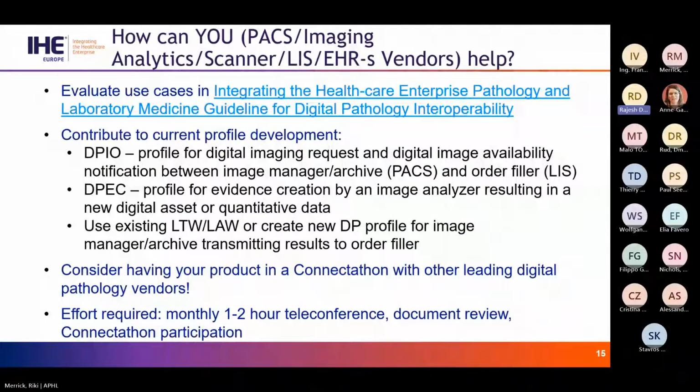Okay, so let me start with how can anyone contribute, and one is to take a look at this link and evaluate the use cases. If there's missing use cases, to indicate that there's a high prevalence need in the market that's not currently being met. And of course, we have a number of profiles in development, which I will step through in more detail, and having your input is critical. I'll give acknowledgement for the DPIA profile.